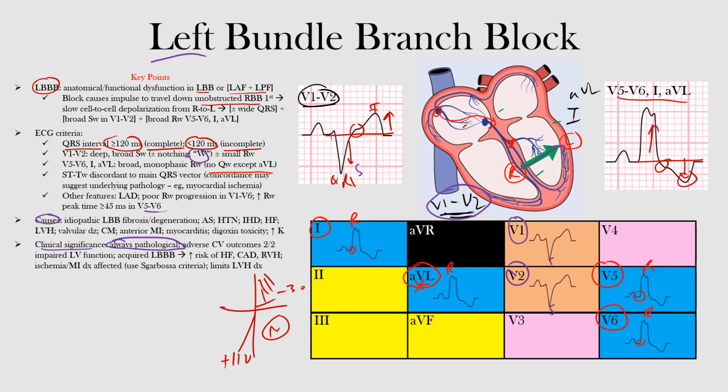And remember, in left bundle branch block, the diagnosis of ischemia and MI, as well as left ventricular hypertrophy, is affected from it. Well, that's the end of this lecture. We discussed left bundle branch block, including its pathophysiology, EKG features, potential causes, and clinical significance. I hope you learned something.